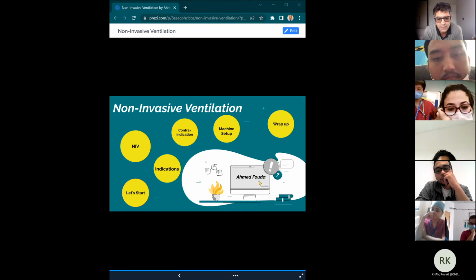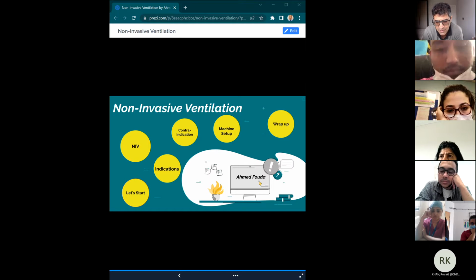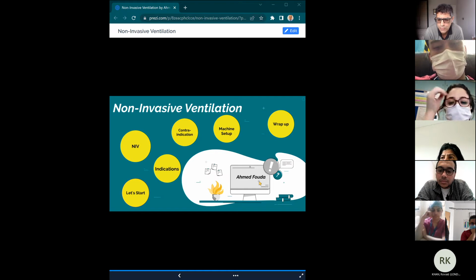Okay, so it causes changes, as Ahmed already alluded. If somebody had a raised ICP or a bit of a head injury, you have to be very careful because you've got increased positive pressure in the thorax, it also increases your ICP. But when people are on a ventilator, we manipulate it so that the pressures aren't too high, or we control the CO2. We increase the dead space, we've said, by increasing the PEEP. We've also increased the FRC, which hopefully improves oxygenation.